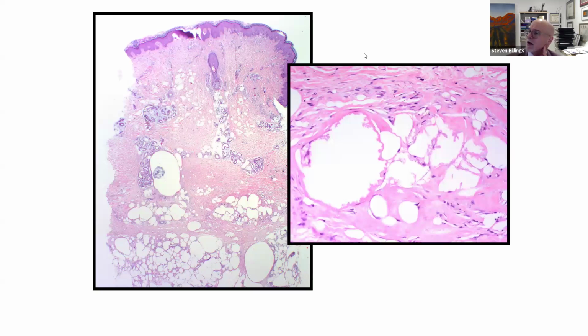So this is what lipodermatosclerosis looks like. You can see, again, it's not very inflammatory. We see this sort of membranocystic fat necrosis where you can see these crenulated borders lining these sort of dead and dying adipocytes, these sort of cystic change within the subcutis.